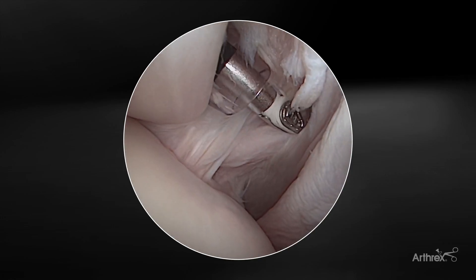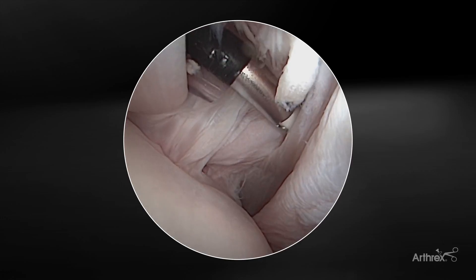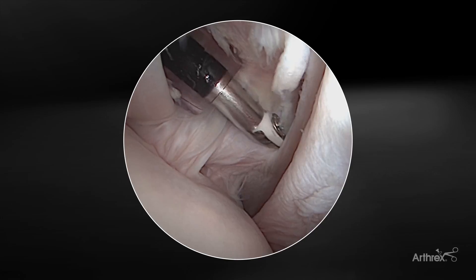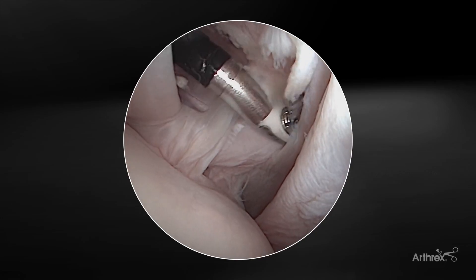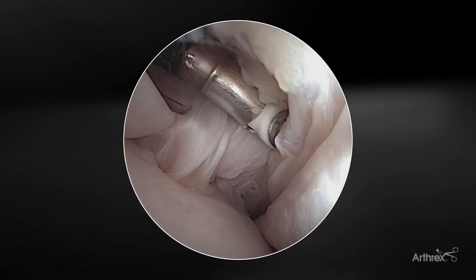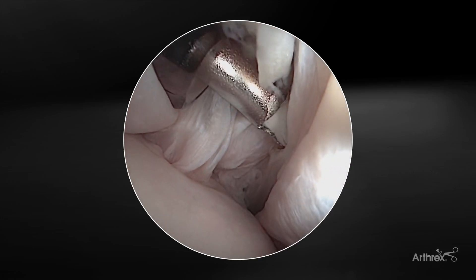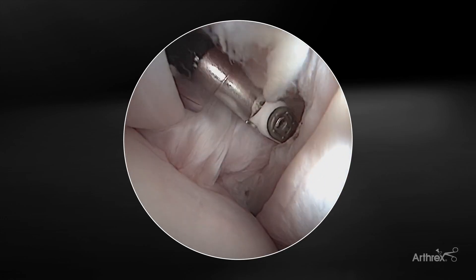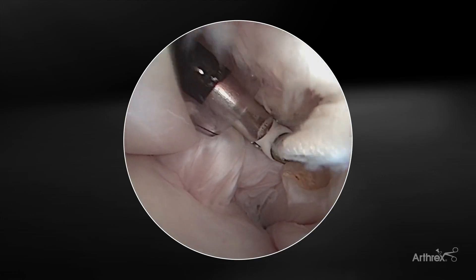As we look into the front of the joint, you can see the MGHL here, which is draped over the subscapularis. Due to the shape and the tapered electrode, it's very easy to get in between tissue planes that may be tight. And as we activate the device, it's easy to loosen up and release those adhesions anteriorly. You can see how efficient this device is at releasing that tissue.